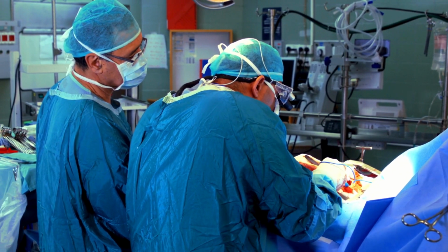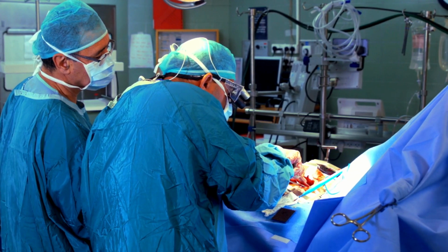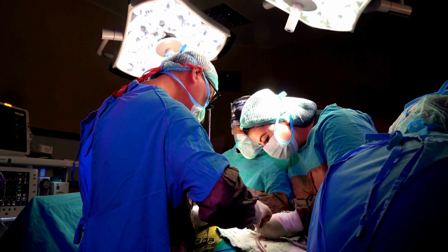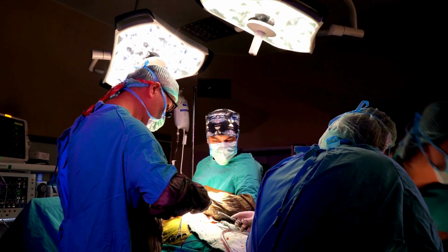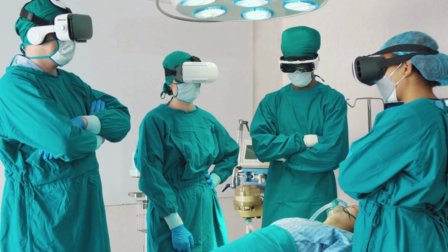Stents are medical devices used to treat narrowed or blocked blood vessels, helping to restore blood flow. There are different types of stents designed for various medical applications. Here are the main types of stents. Coronary stents. Bare metal stents, BMS. These are metal mesh tubes placed in narrowed coronary arteries to provide structural support.